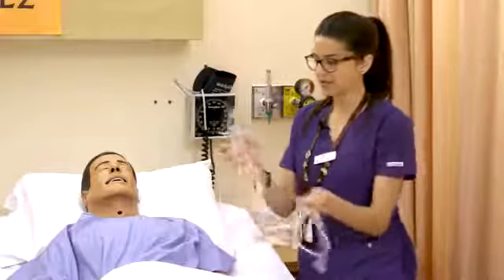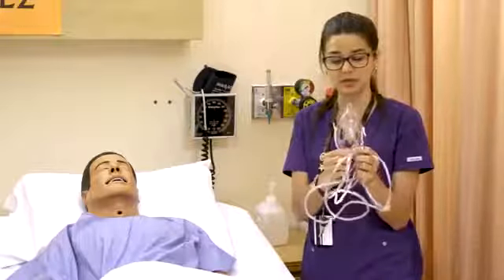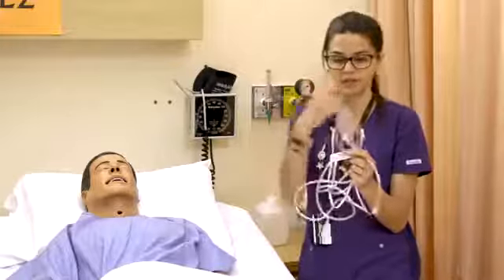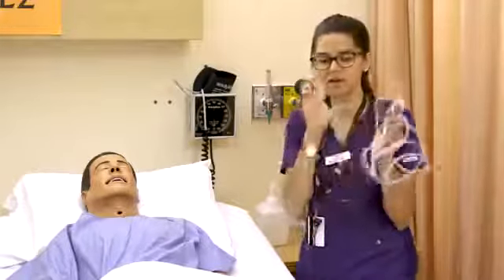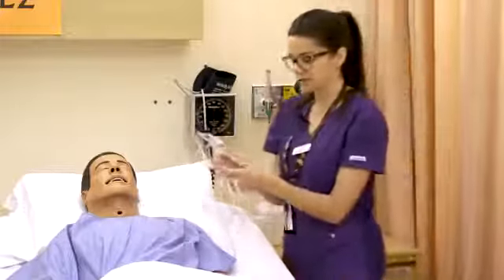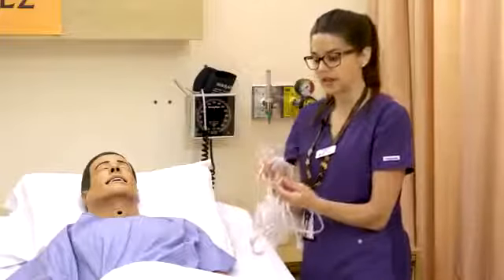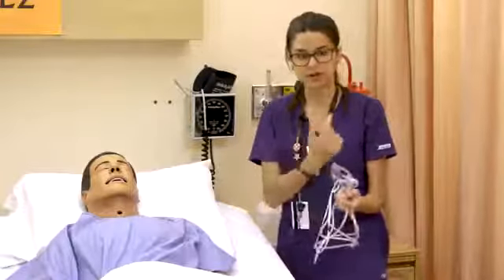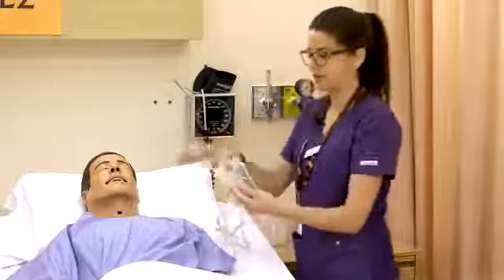I'll just show you the mask itself. It's really nice for people who are maybe a little bit claustrophobic because it has these open windows. So the person is getting some room air there too, obviously, and they don't have that closed-in feeling of the plastic mask. The other benefit of this one is you could put a straw through there so the person can actually sip fluids while getting kind of high flow delivery of oxygen, which isn't the case with the simple face mask or the rebreather and modified non-rebreather.